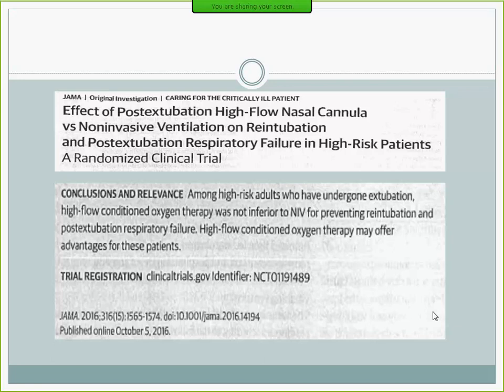Other than non-invasive ventilation, the newer mode is, you could use high flow nasal cannula. This is another mode of kind of a mechanical ventilation. It's a low level CPAP basically. It's a machine that gives you a high flow that comes through a special machine and a nasal cannula. And some patients just like it.